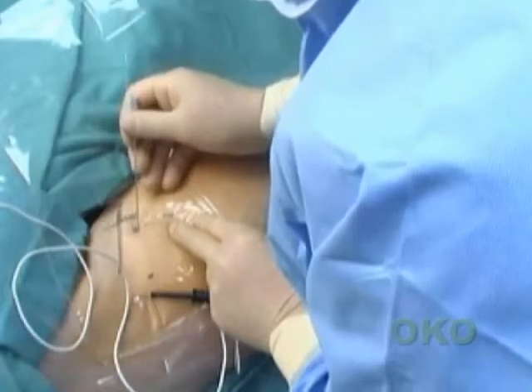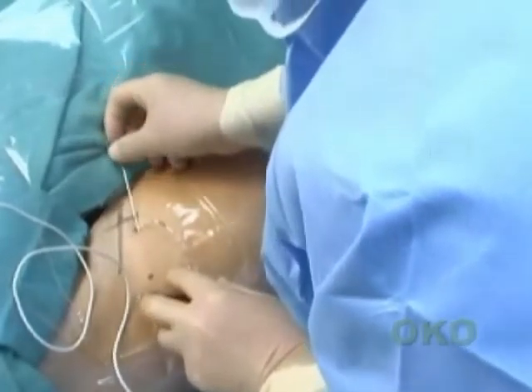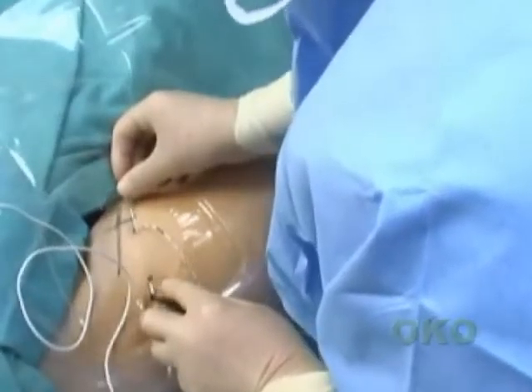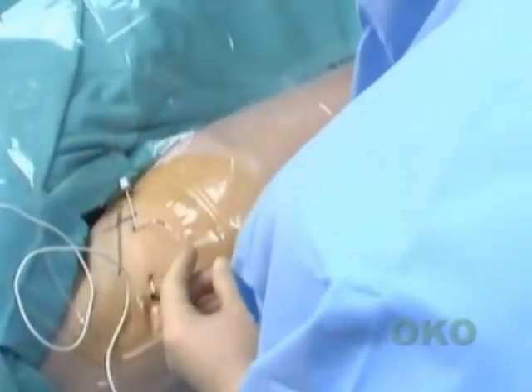The catheter is tunneled by first inserting the inner stylet of the needle 1 to 2 millimeters from the catheter exit site if a skin bridge is required, and advancing it subcutaneously to a point approximately 8 to 10 centimeters laterally if this is appropriate for the surgery. This area has previously been anesthetized. The skin bridge will make removing of the catheter easier, but this has to be balanced against a higher frequency of leakage of the catheter.